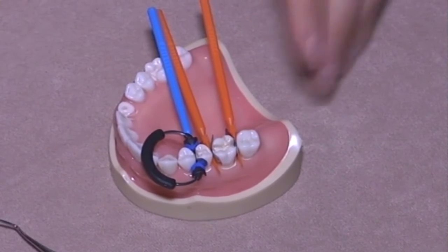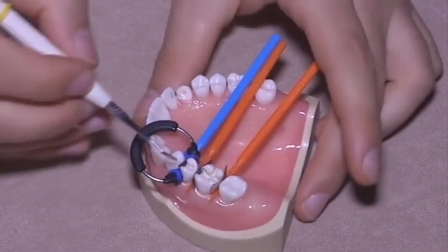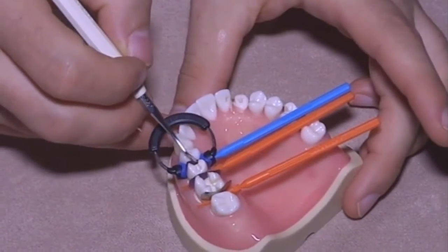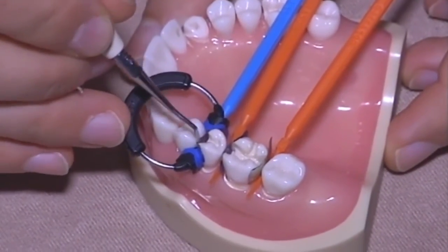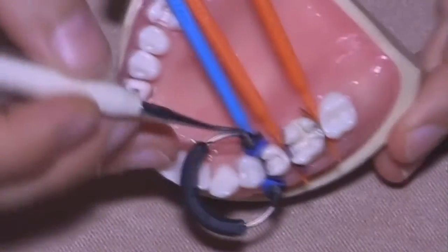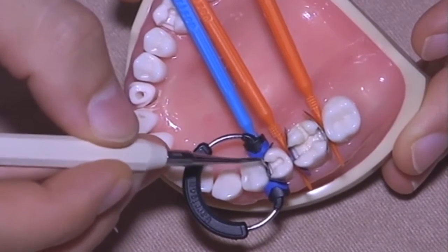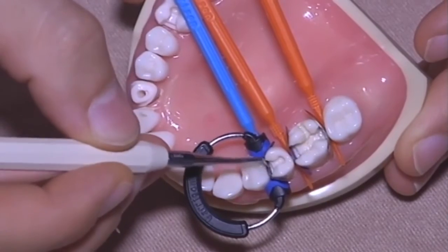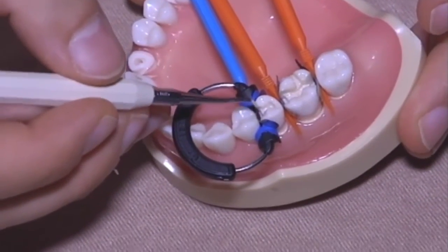Now of course we start with the interproximal wall here. Just check that the shape of the matrix is perfect. You have to check that it closes even the floor of the cavity, even the actual walls of the cavity.